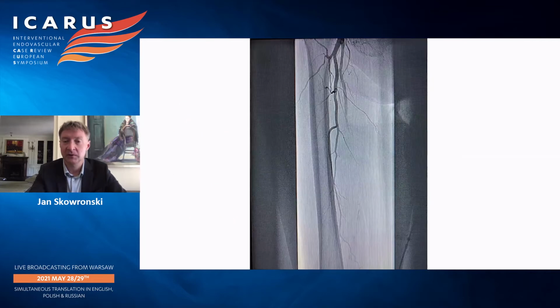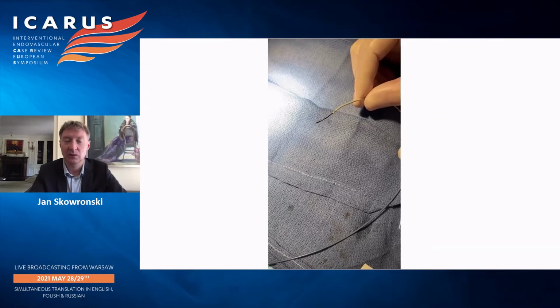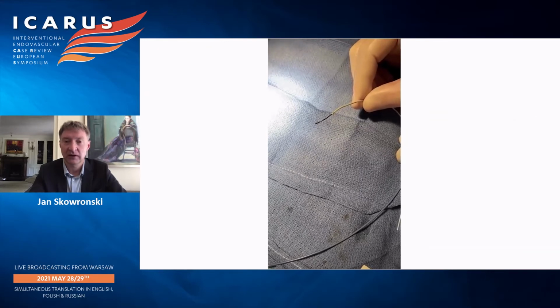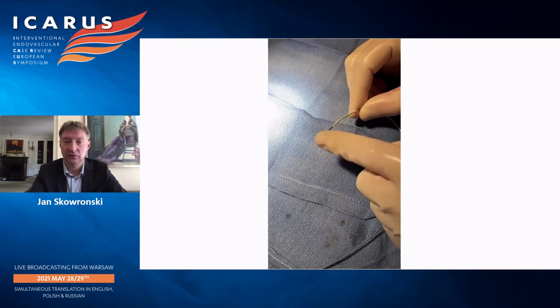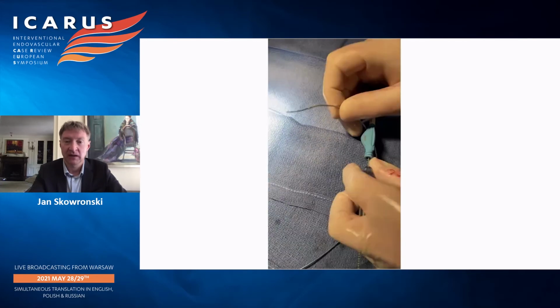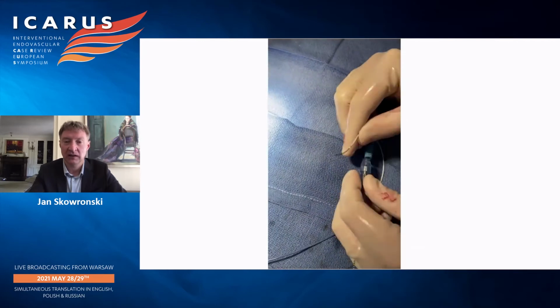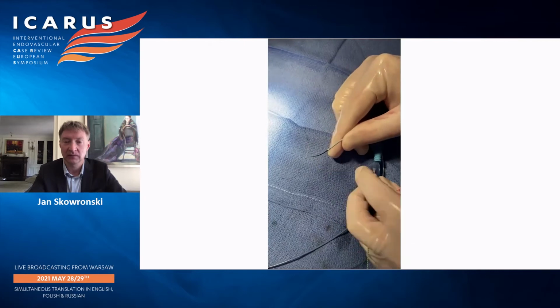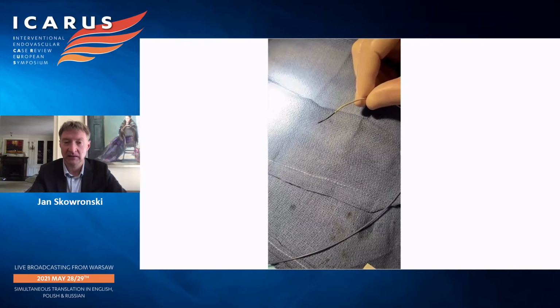This is just a typical angiogram of SFA occlusion. This is something that we all see every single day in our cath lab. So this is what I do. I advance the Glidewire through the angled Trailblazer catheter, but remember that the catheter should be angled, and the wire also is angled. Then I get a torquer at the other end, and I close the torquer, and I essentially treat it as one unit, so the wire doesn't move in relationship to the catheter.